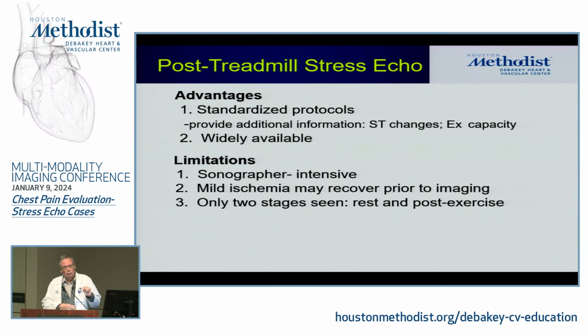The limitation is that of all the stress echo modalities, this one is the most intensive for a sonographer, because again, you have about 90 seconds to acquire your views. You're trying to acquire the same views you had at rest, which means you have to keep some sort of memory in your brain of how these views look, so that when you go right after and start imaging, you're trying to reproduce very similar views to what you had during rest. And of course, the resting images were done relaxed, without any pressure, so you usually got some nice images, and now you are working against time to get some decent images.